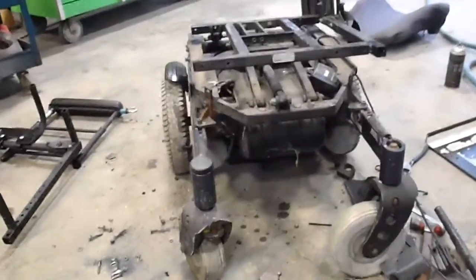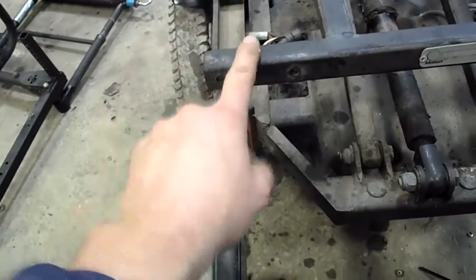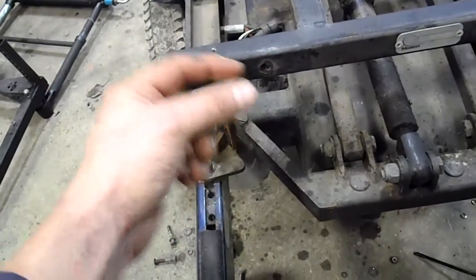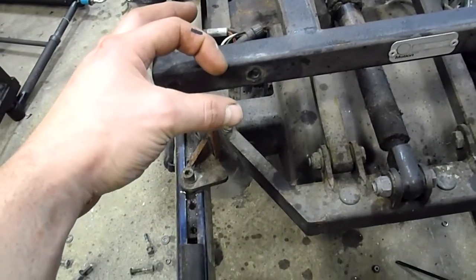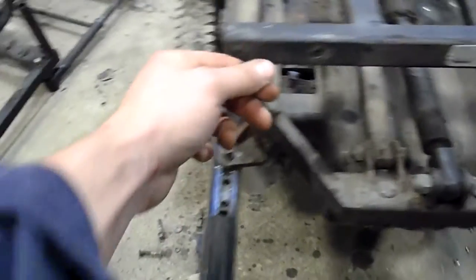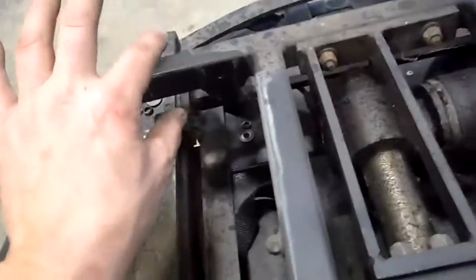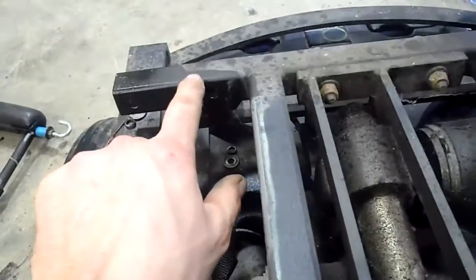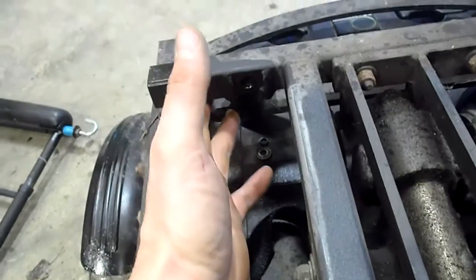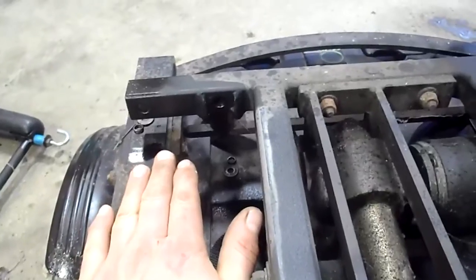And then just one nut up here where it's really easy to get at. I'll weld a tab on right up at the front of the frame here, or even maybe just drill a hole right through there, if I can. I gotta watch if it affects my slide here. Even if I double this up and put another piece of square tube on the end, or a chunk of angle iron, I can bolt right through that. So all you have to do is take an impact or something, pop those two bolts out. The back will probably have some sort of a bracket that goes on here, or a pin. Maybe I'll put an eye underneath here so the back of the seat slides in there, or maybe just a fork that holds onto that, or a hook that goes right underneath it. That'd probably be the easiest. And then the rail will sit right in there.